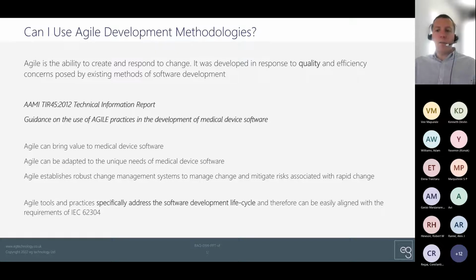As I said earlier, provided you're following sound engineering principles, true for your broader device as well, and you're not just hacking things together, you've got most of that solid foundation on which to build your documentary evidence.